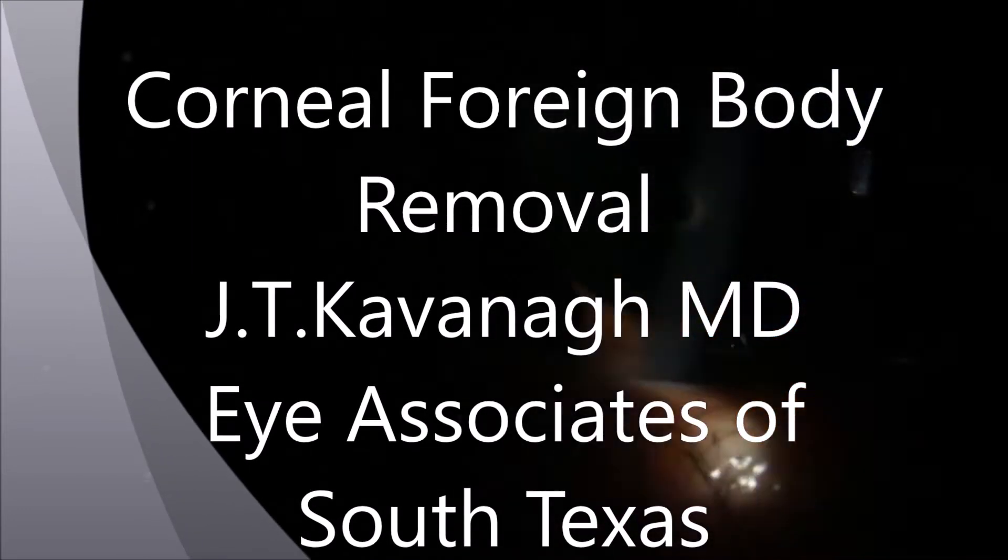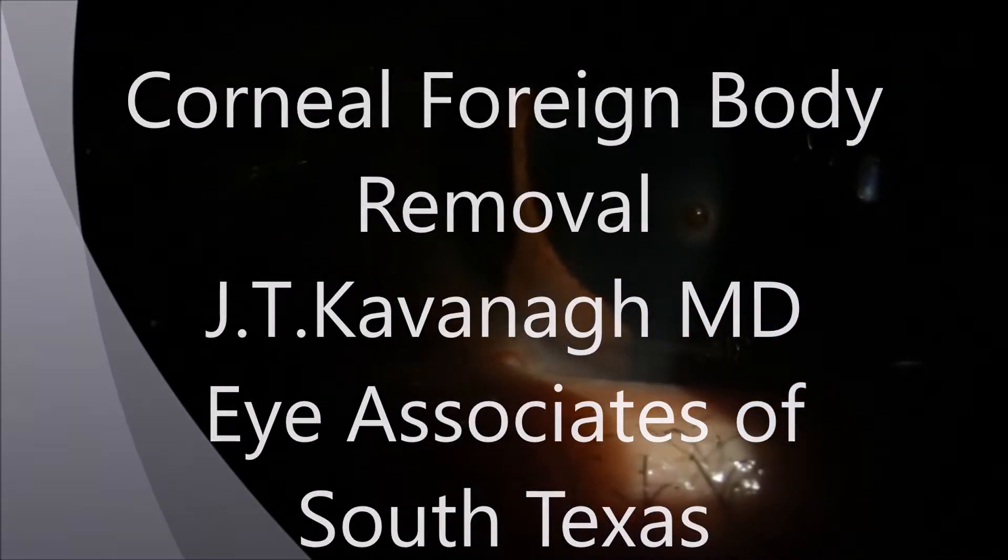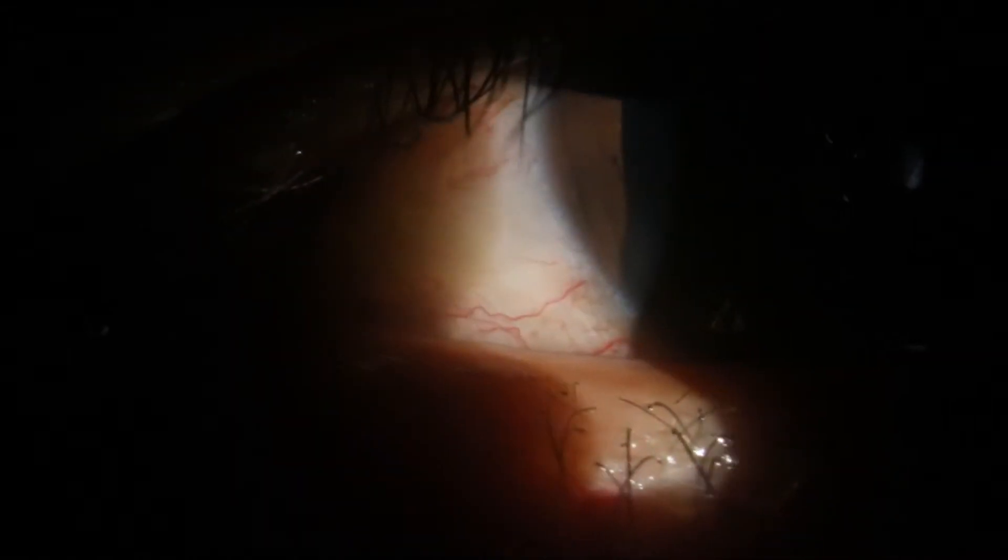This is a common ocular injury, frequently seen in metal workers. This is a superficial corneal foreign body, and this is easy to remove with a slit lamp.